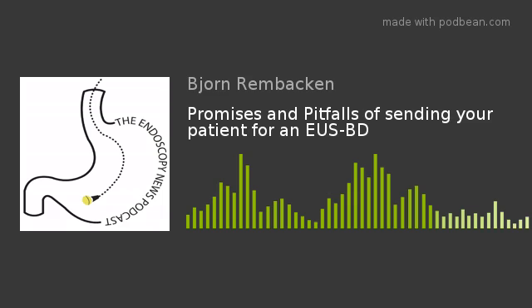The majority have been for patients with biliary stone disease who have not been candidates for surgical resection. And most of these would have been patients who've already had their gallbladder removed and are either not fit or have declined surgical intervention. In those patients, a PTC is going to be less favourable because it's very difficult to get out big stones via a PTC, basically, and to prevent the patient from being left long-term with a biliary drainage bag.